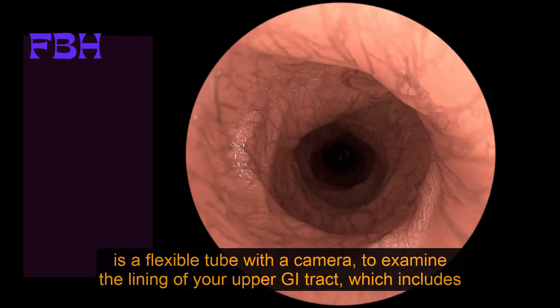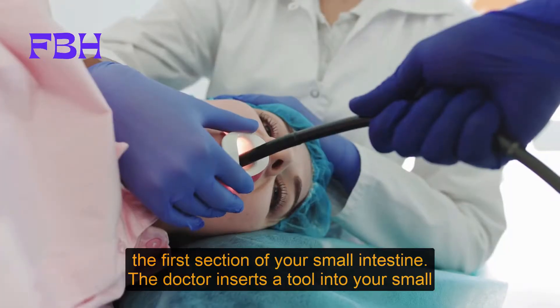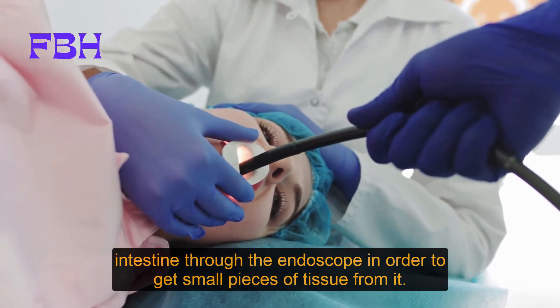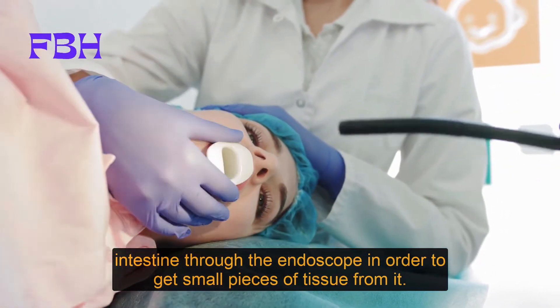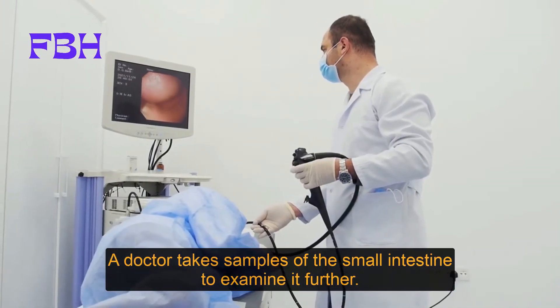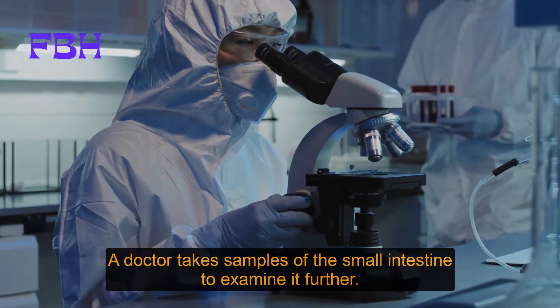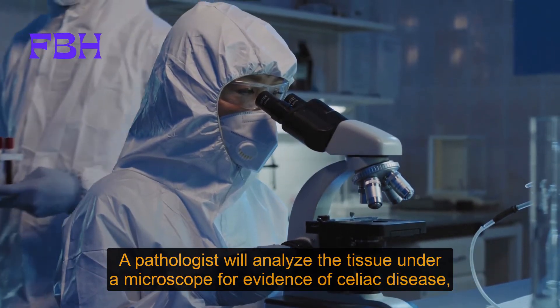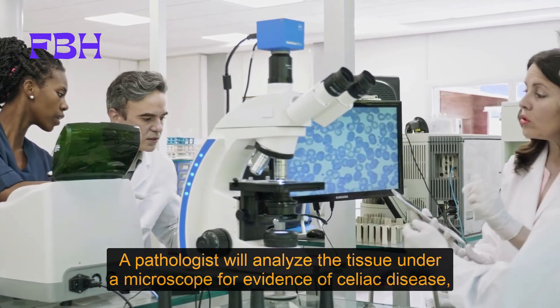The doctor inserts a tool into your small intestine through the endoscope in order to get small pieces of tissue from it. A doctor takes samples of the small intestine to examine it further. A pathologist will analyze the tissue under a microscope for evidence of celiac disease and will make a diagnosis.